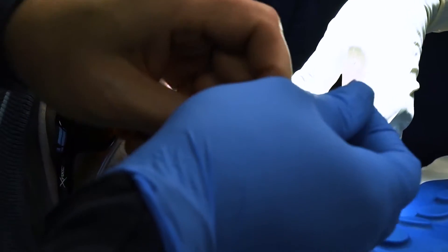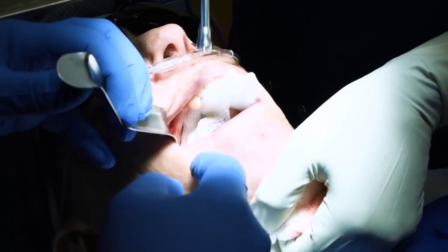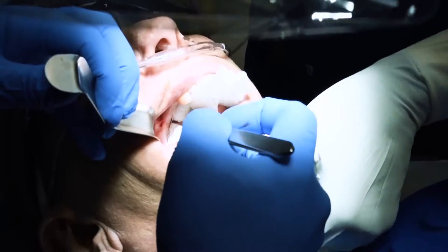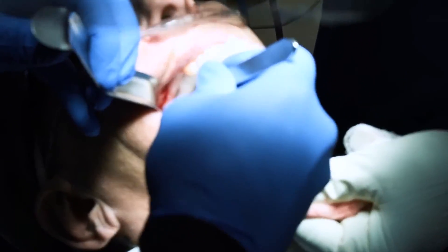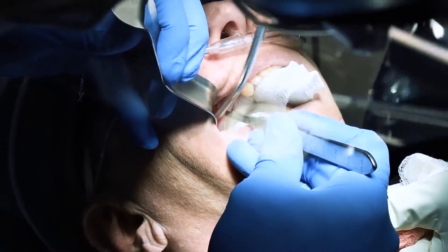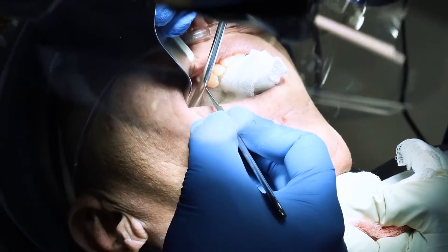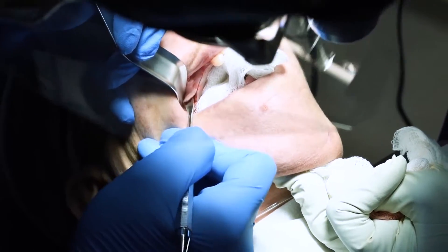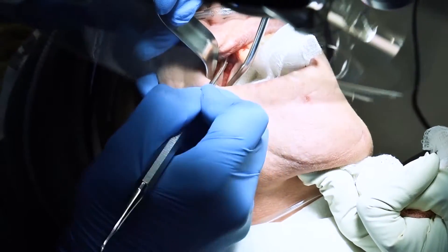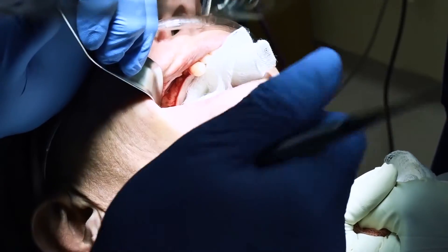Step number one is get the plate out. I'm making sure my incision is big enough and I have a big enough flap to cover the entire area, including enough laxity in the tissue to remove that plate, place the implant, and then close things up as well. So there's my incision. Now what I want to do is raise a flap. Because of the injury and the trauma, this tissue can be pretty tenacious and difficult to elevate, but not always.